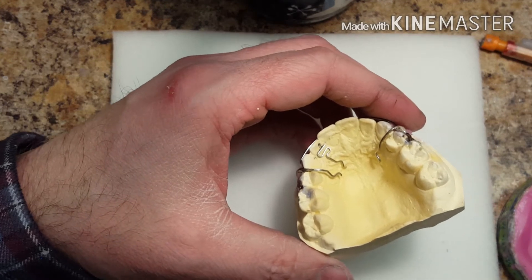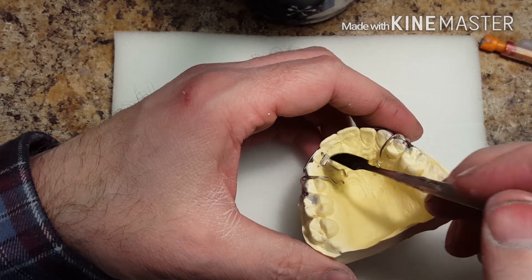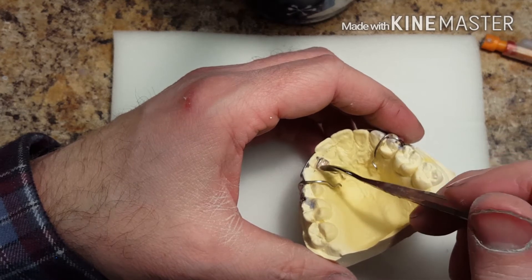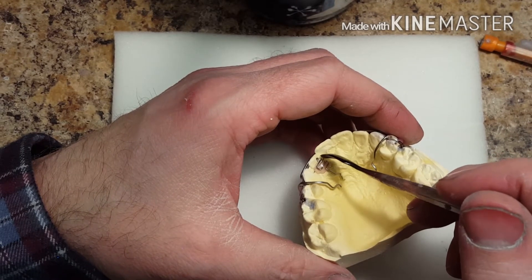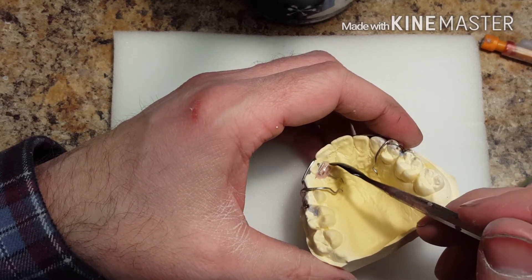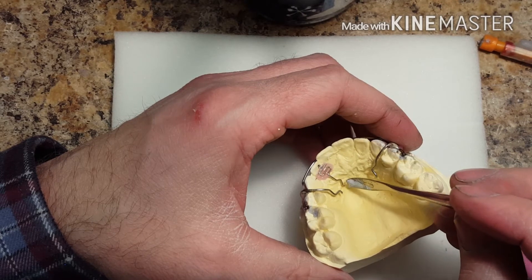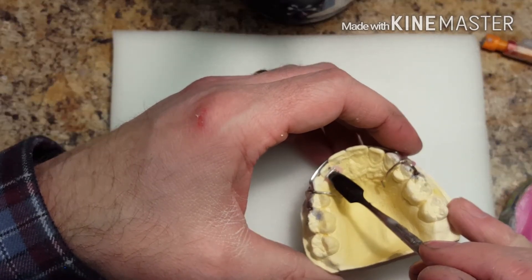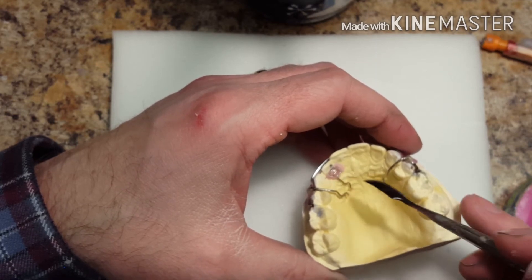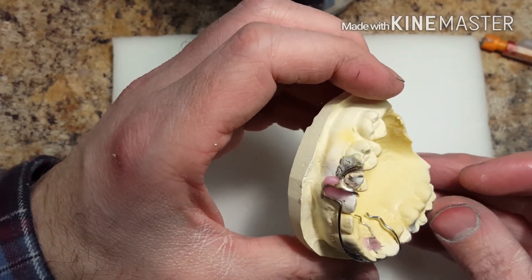One of the main keys to making this appliance really nice is when you add the wax, you want to put a nice, real thin little layer. Make sure you wax in the spring where it's not too thick, because any positive wax on top of the spring is going to be a negative for the acrylic — it's going to make it too thick. The thicker your wax is, the thicker your acrylic is going to be. What ends up happening is the lower teeth are going to end up biting into the spring. By making a nice thin layer, you can build up the acrylic and have a nice thin result.